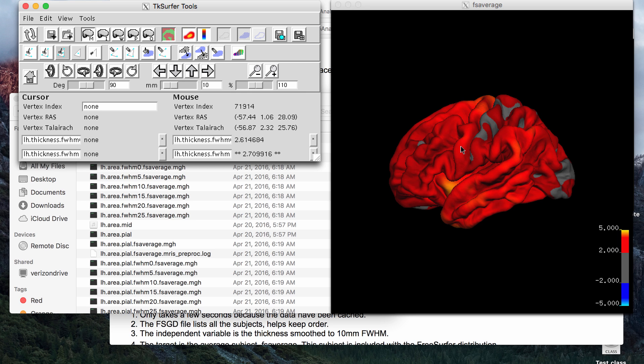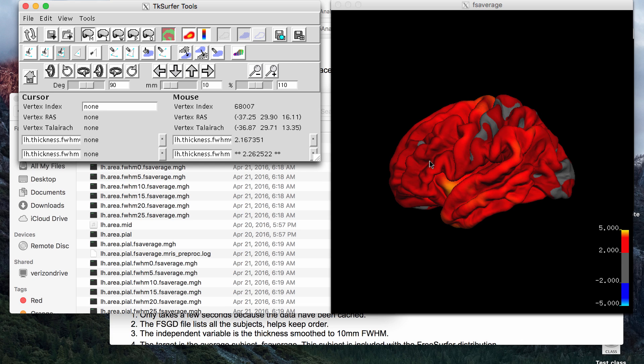and for a group of controls, you average all the thicknesses, and then you can compare that to the thickness of a patient, for example, and get clusters. So this is cortical thickness.